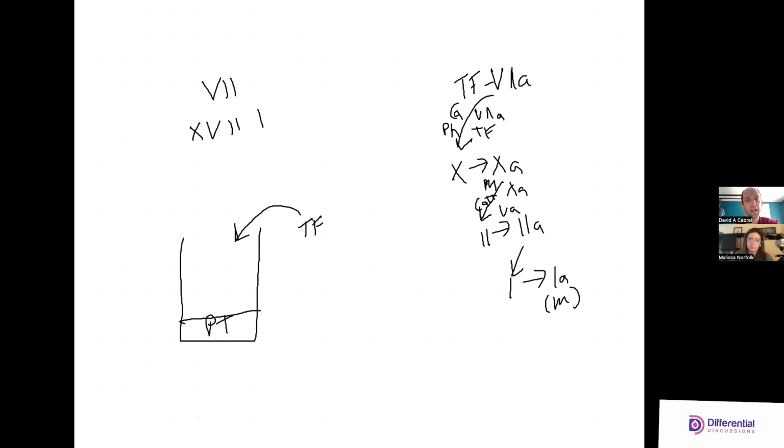And then once we have fibrin monomers present, the analyzer will stop. Again, depending on mechanical or optical, that will determine the endpoint. I think the other thing that's really important when we talk about the PT is the INR.